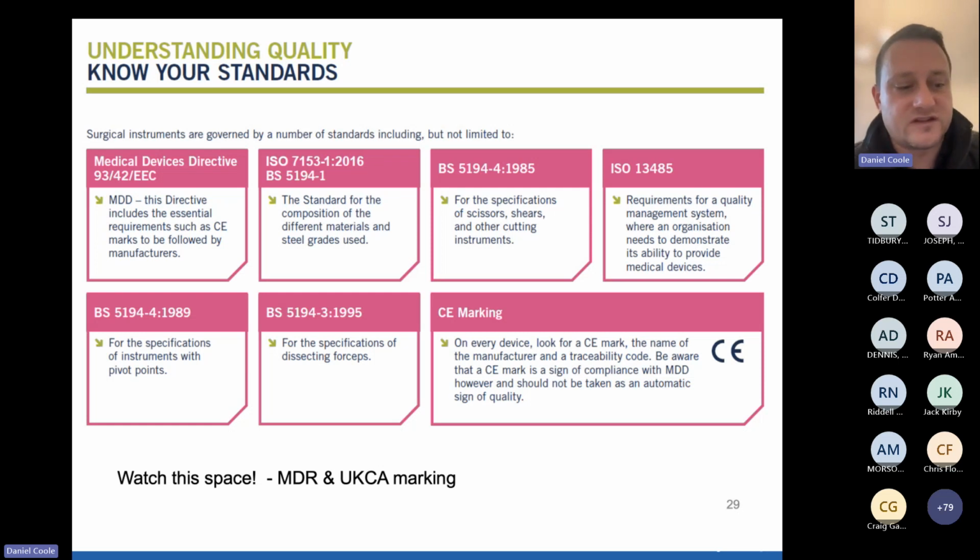So whether the steel is from Germany or from Pakistan or from the USA, it's crucial that it meets these requirements. The reason for this is, of course, that it depends on the application, and different steels have different applications. Very, very important. I think a lot of Japanese steel is used in surgical instruments nowadays, and again, provided that it meets the right specification, it should be fine to use for surgical instrumentation. I'm going to tell you a few reasons why that is along the way.